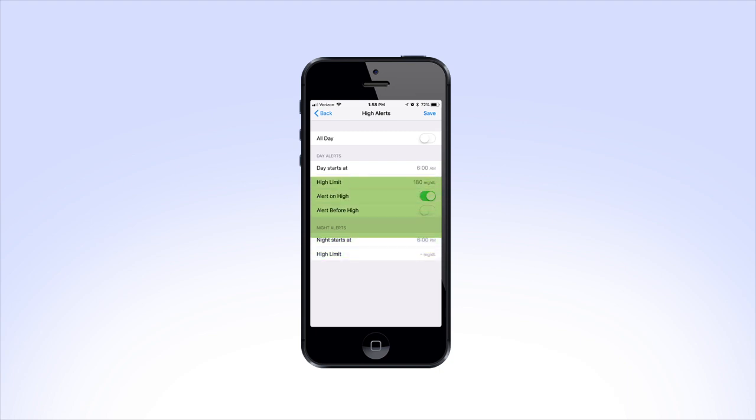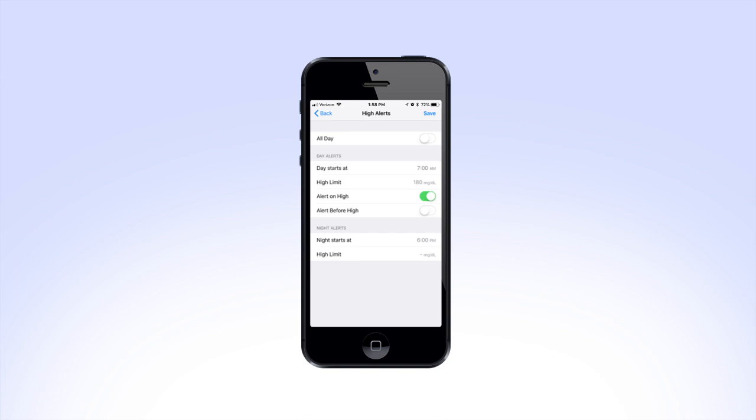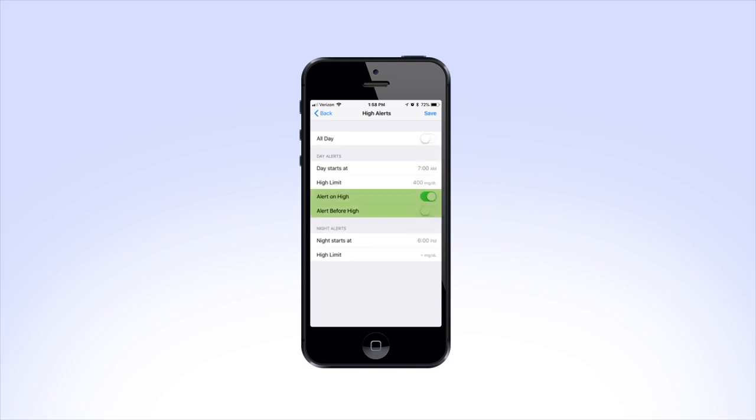Let's start with Day Alerts. Here you can change the time you want your day to start by tapping on the time and scrolling to the time of your choice. Next, tap on High Limit and select the limit you would like to be alerted.